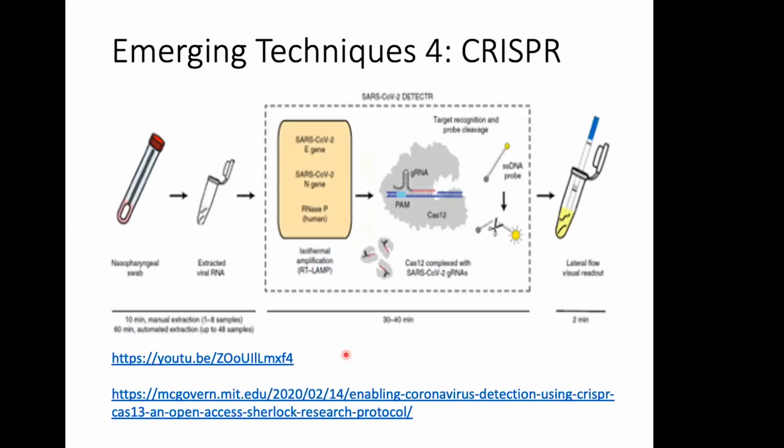And this is a very exciting technology, which is being developed by Broad Institute. So Broad Institute is a research institute combining MIT and Harvard. So you can imagine the brains that have been pooled there. It's a combination of MIT and Harvard. So they recently developed this 2 years ago using CRISPR. CRISPR is a gene editing technique, and they have developed a sensor based on CRISPR.